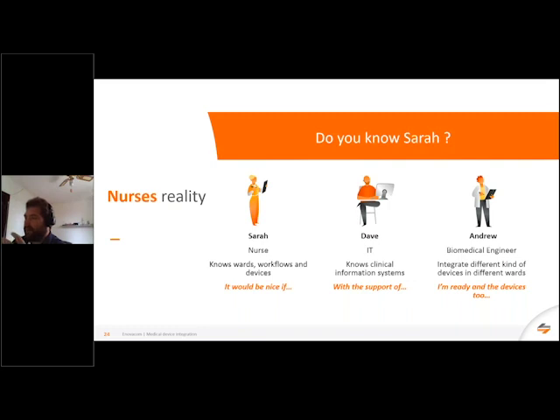I will talk about Dave and Andrew because they are directly linked with Sarah's work. Dave, as an IT administrator, helps Sarah if she has trouble with, for example, a Windows password. And Andrew is a biomedical engineer who will be involved in the project. It would be nice for Sarah to avoid manual vitals writing and reporting to the EHR. Thanks to this time saving, she could take more time for a break, reduce her stress, and take more time for patient care.